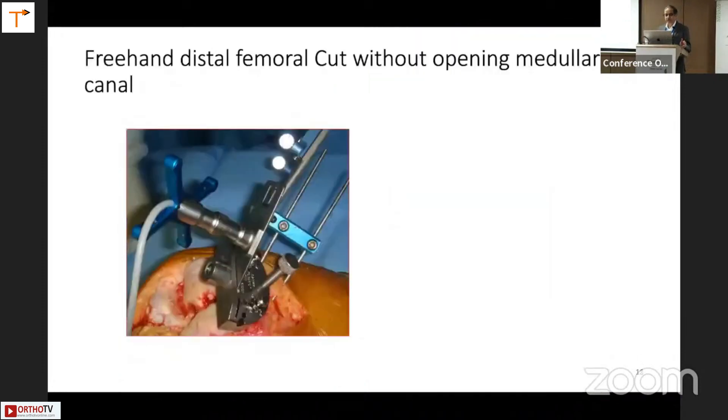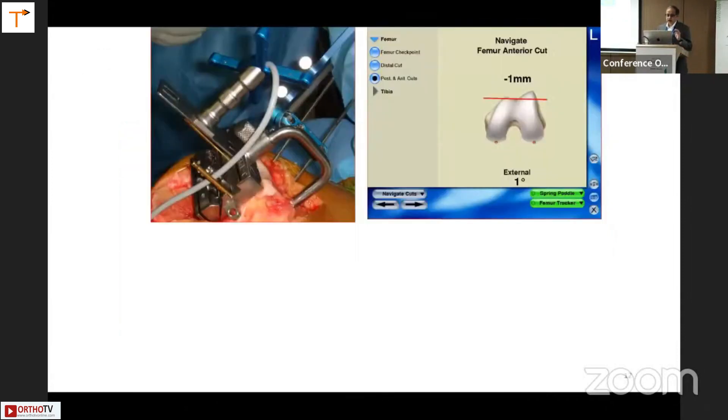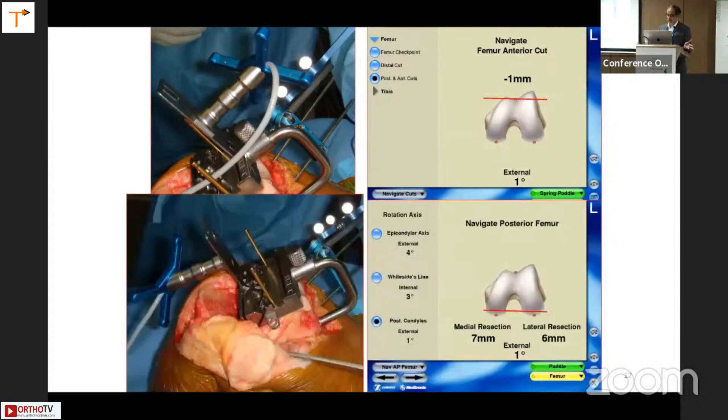There was also an option of doing a freehand distal femoral cut without opening the medullary canal, which would reduce bleeding, but was fiddly. This was the kind of screw one could put in the intercondylar area for the freehand technique. Rotation was also being judged, showing external rotation with respect to the posterior condylar axis. It had options for all three axes used for judging the rotation of the femoral component.